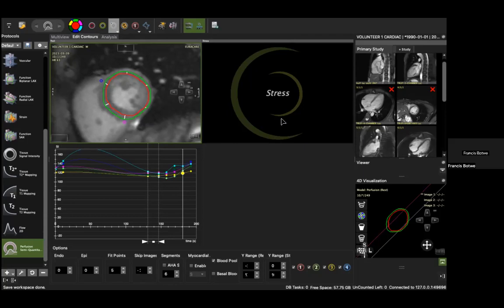One question again. Where do you install that software? Is it at the workstation or the acquisition or both? At our site, we have the software on a computer that's right beside our scanner. And a lot of our researchers also have the software on their private computers. So we can do it both, offline.